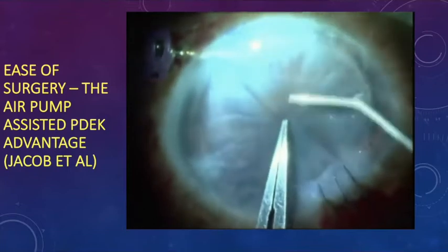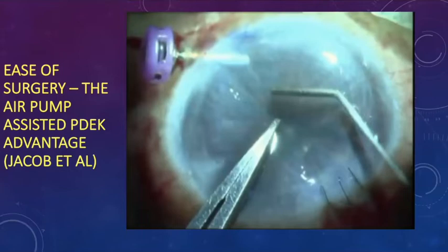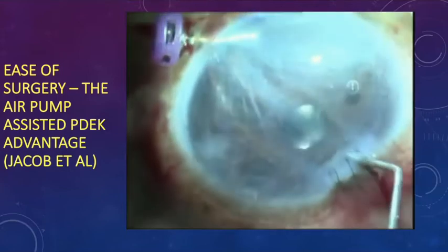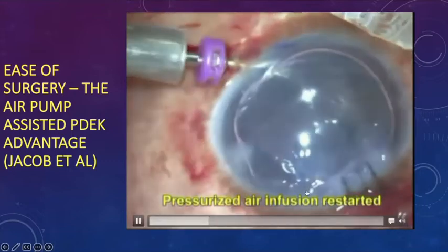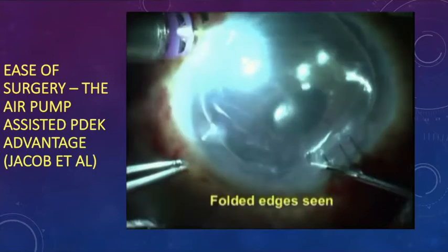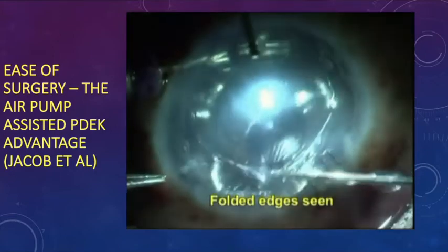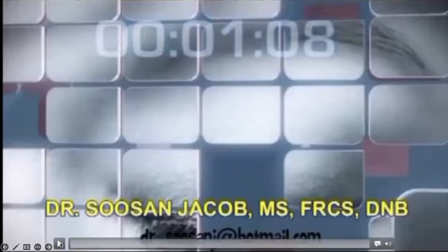Here you can see me unfolding and floating up the graft. You'll see soon there's a peripheral edge fold, which I'm not going to be too much bothered about, because I'll be able to look at that peripheral edge fold. I will just unfold this using the air pump assisted PDEK technique, and that gives me a very, very good well placed graft. So here's another video.